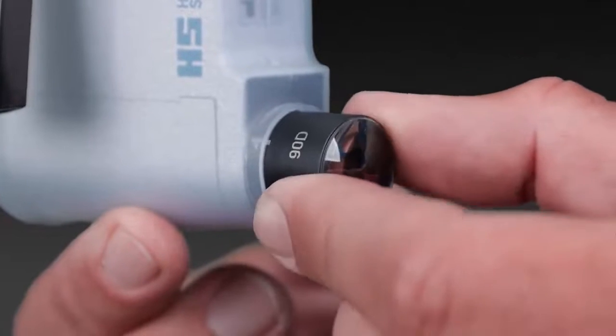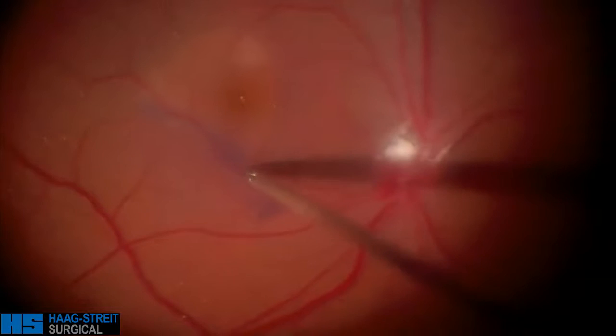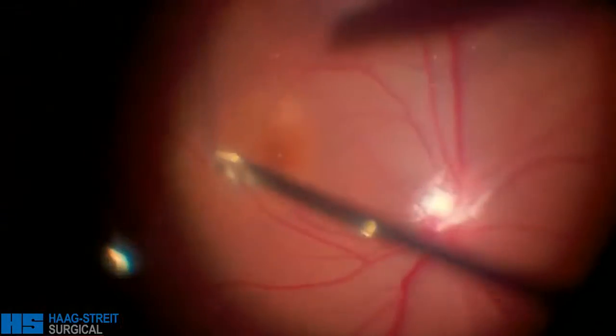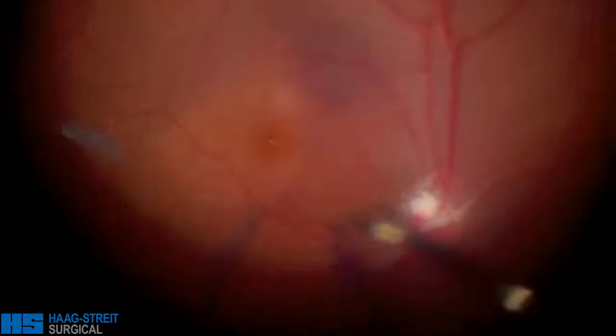For macular procedures, the 90-diopter lens with a 90-degree angle is available. This lens provides higher resolution and magnification for precision procedures. All lenses are available for reconditioning and single use.